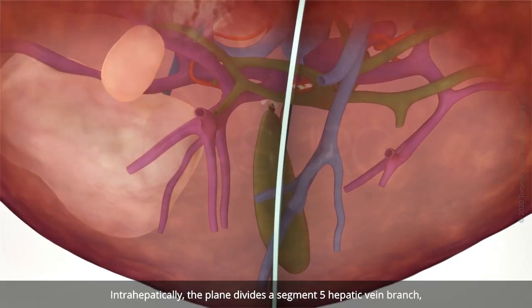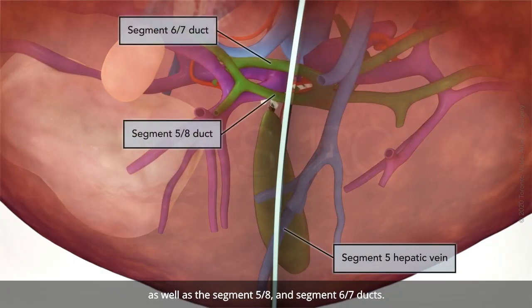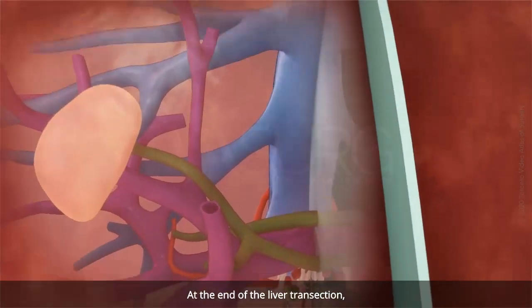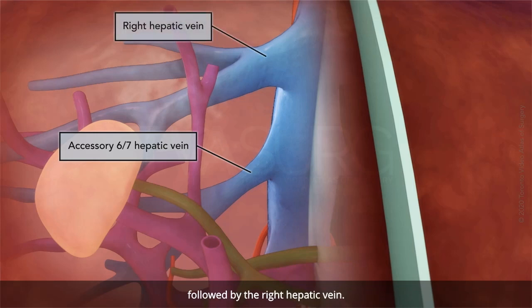Intrahepatically, the plane divides a segment 5 hepatic vein branch, as well as the segment 5-8 and segment 6-7 ducts. At the end of the liver transection, a large accessory 6-7 hepatic vein branch is divided at its root, followed by the right hepatic vein.